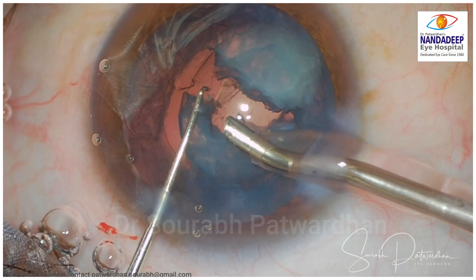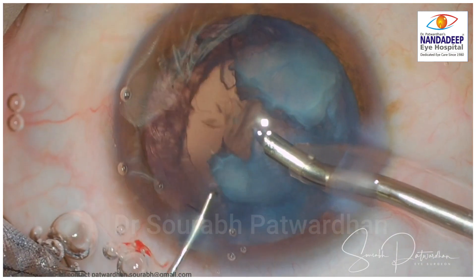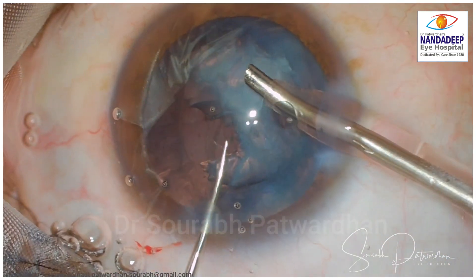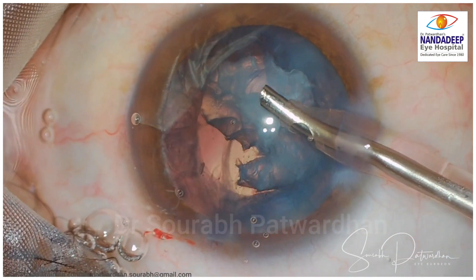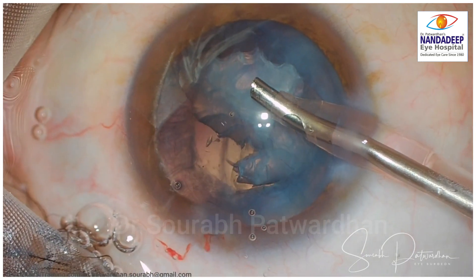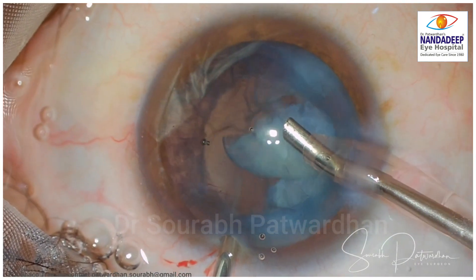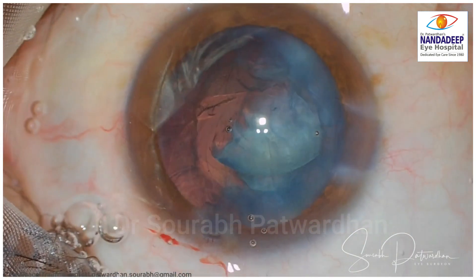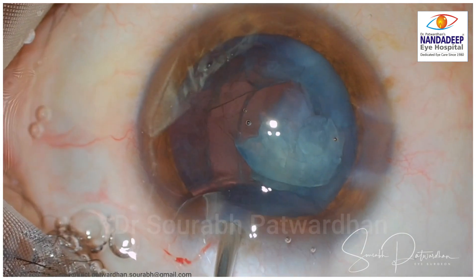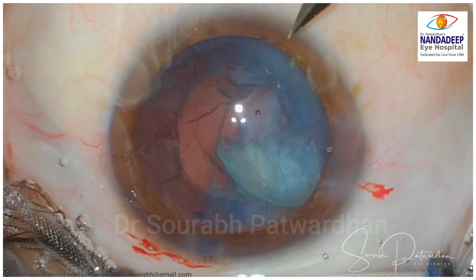I have to now replenish the anterior chamber with OVD before I remove the phaco probe. This is what we call aqueous visco exchange. This is to maintain the anterior chamber as I withdraw the phaco probe, which avoids further prolapse of the vitreous. Now I will analyze the situation.